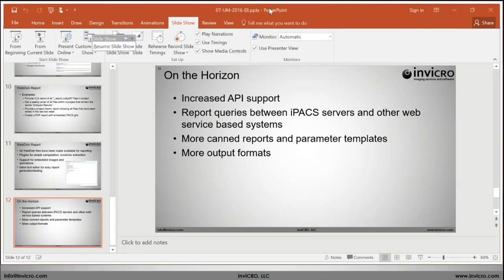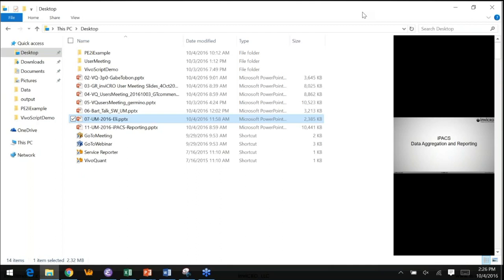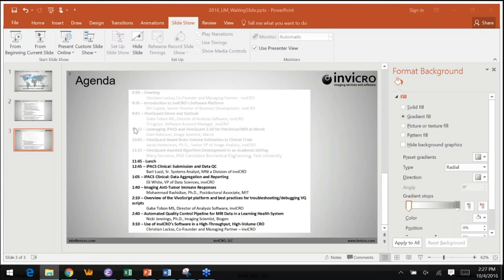Yeah, as Bill said, I did this last year. It was a relatively simple script. It wasn't a complete disaster, so I guess that was the bar to get me to try this again. I'm going to go for a little bit more of an ambitious goal this time. I think last year we loaded an image in VivoScript, then saved some QC images. And this year I'd like to, hold on, let me pull up.